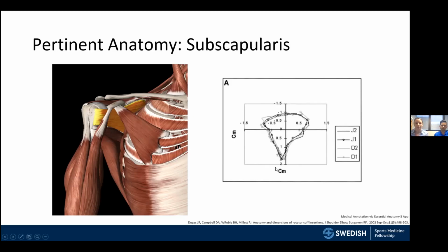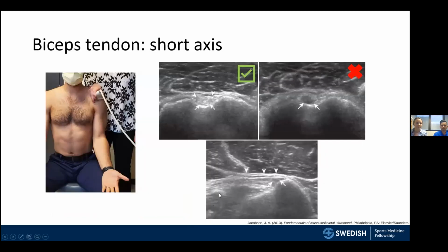And this picture is depicting the plotting of the area around the tendon. So broader at the top and more narrow at the bottom. And they also threw out some numbers for the footprint itself. The length of the insertion from superior to inferior aspect is on average 2.43 centimeters, and the width of the insertion on average from medial to lateral is 1.79 centimeters. So these are kind of our normal scans. We'll get into our case in a little bit.